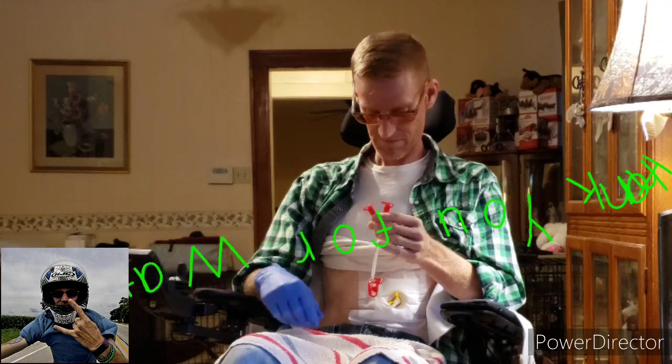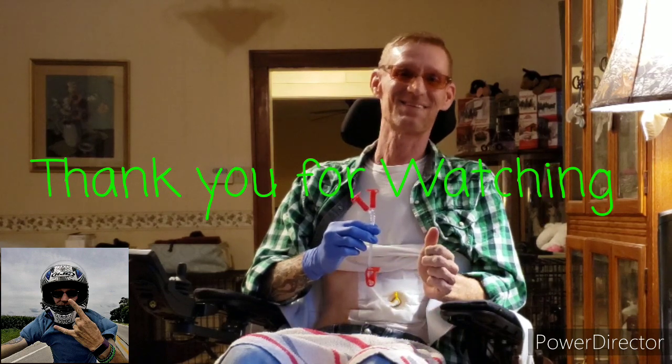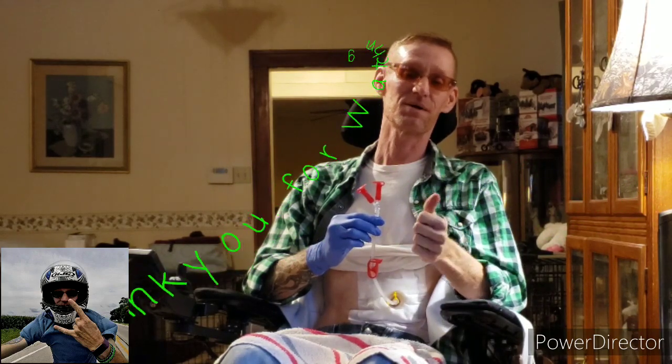Dinner is served. Where is dessert? So not an instructional video — just a series for me so I can learn to make sure I'm doing this properly.